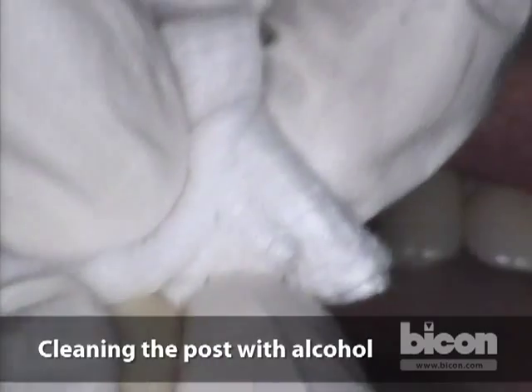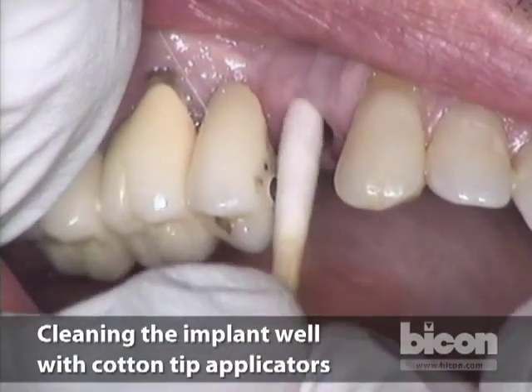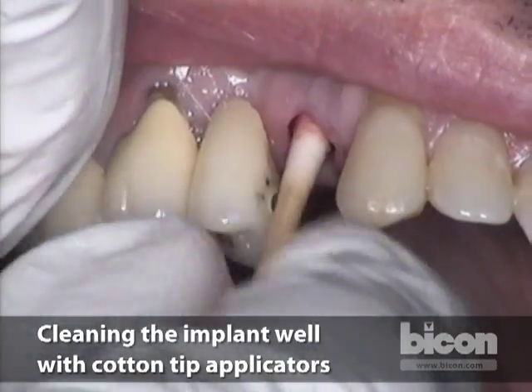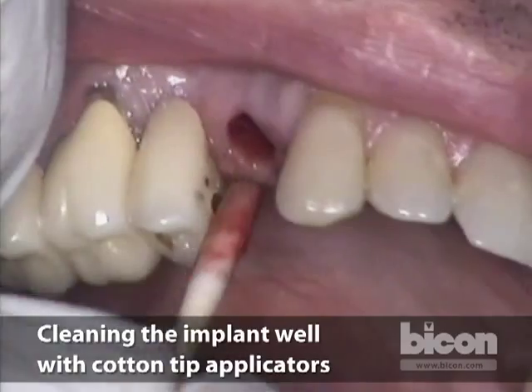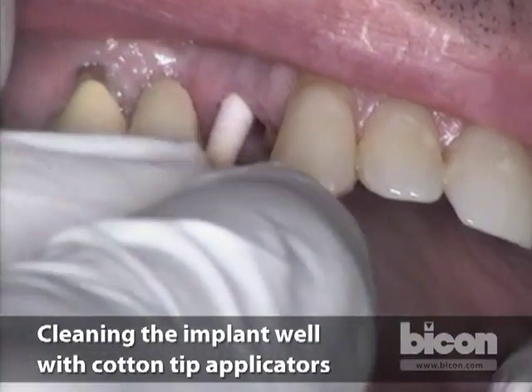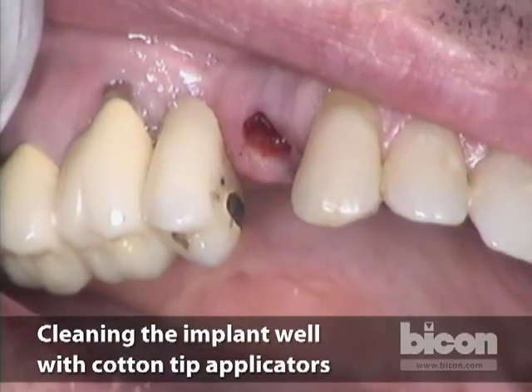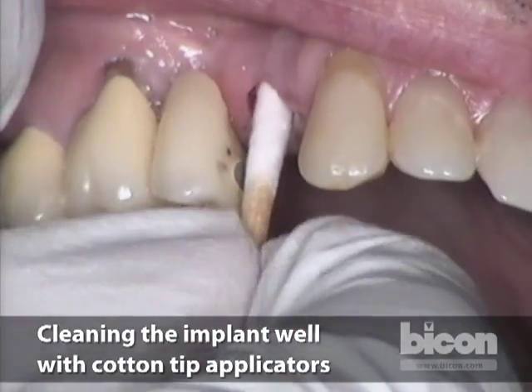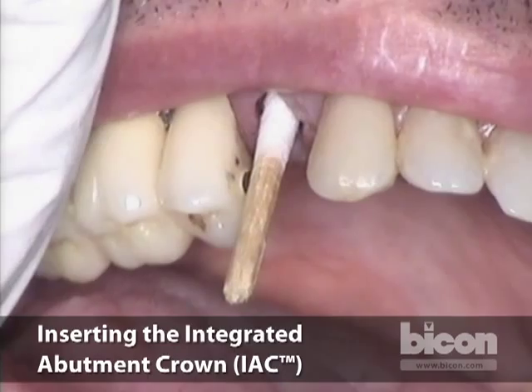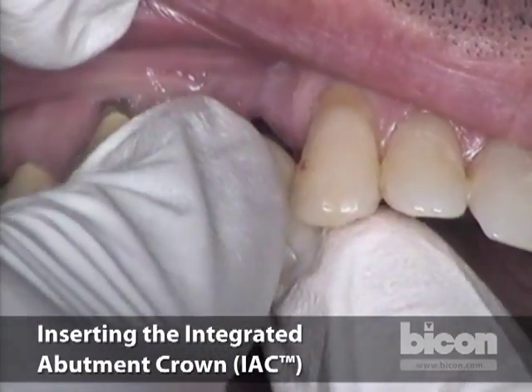We begin cleaning the post with alcohol and go to the mouth to clean the well. This is not absolutely necessary in a posterior area — we mainly do it in the anteriors to obtain the best adaptation of the metals of the abutment in the well — but we do it here to show you. A three millimeter cotton swab has the exact same size as the implant well, so it cleans out perfectly. We remove that and insert the crown — press it, rotate, and go with the crown and the abutment.